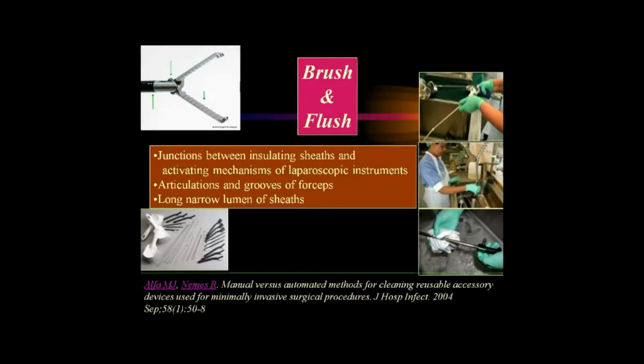So there are special toothbrushes, long brushes, and wide or soft brushes available for this purpose. And we need to teach our staff to use all these equipment so that they do not damage the equipment, and at the same time do the job of cleaning very well to minimize the bioburden to an acceptable level.